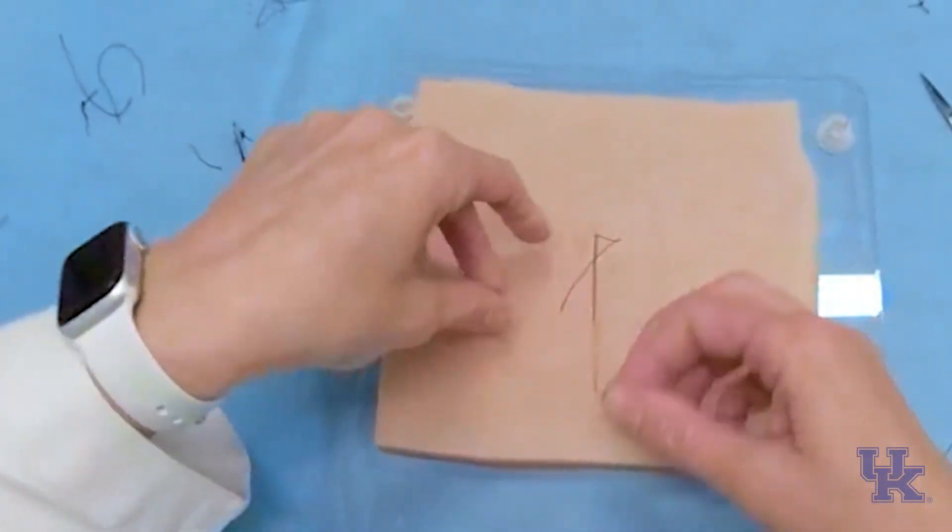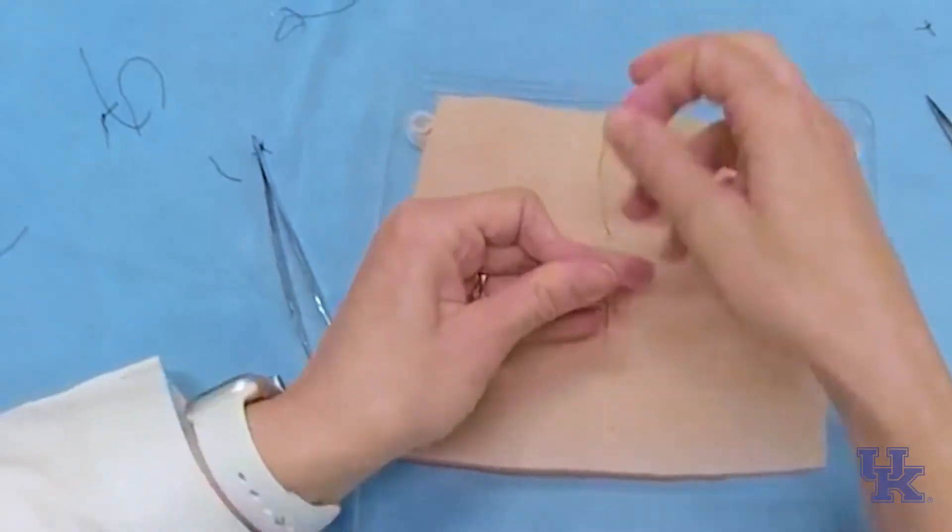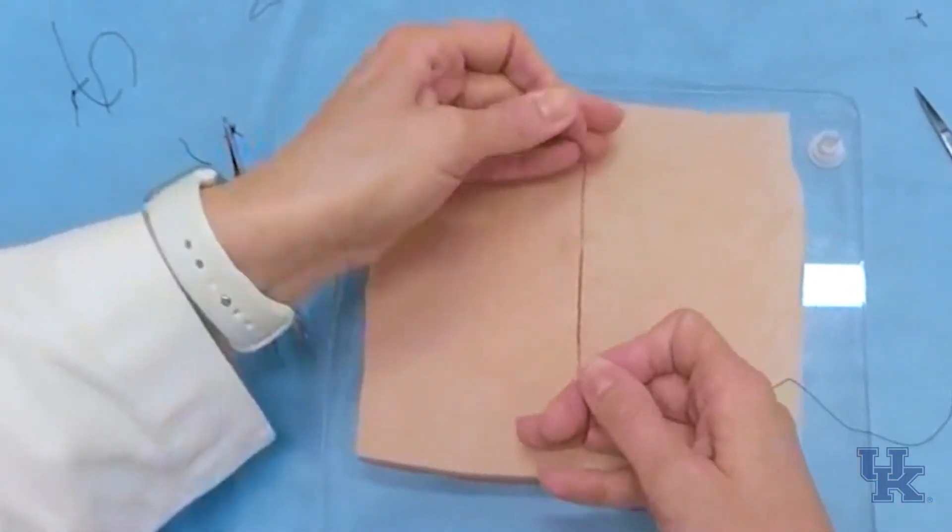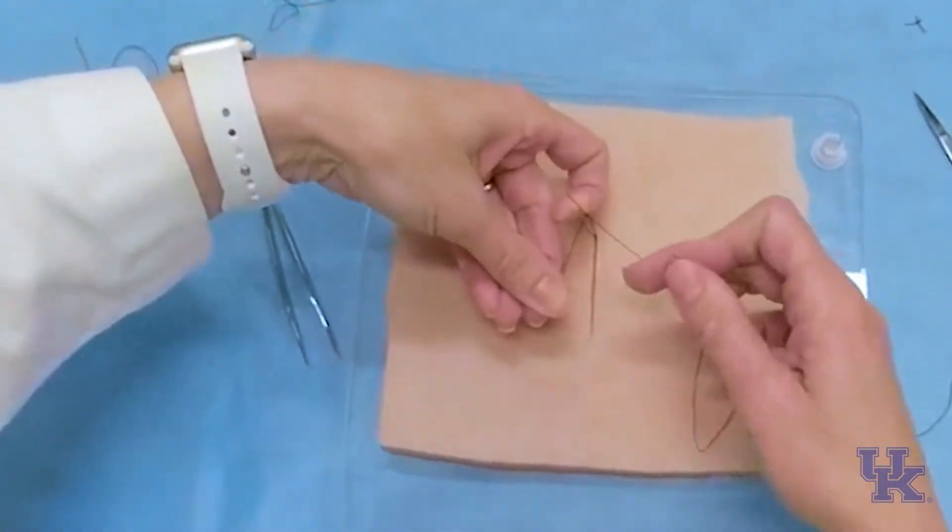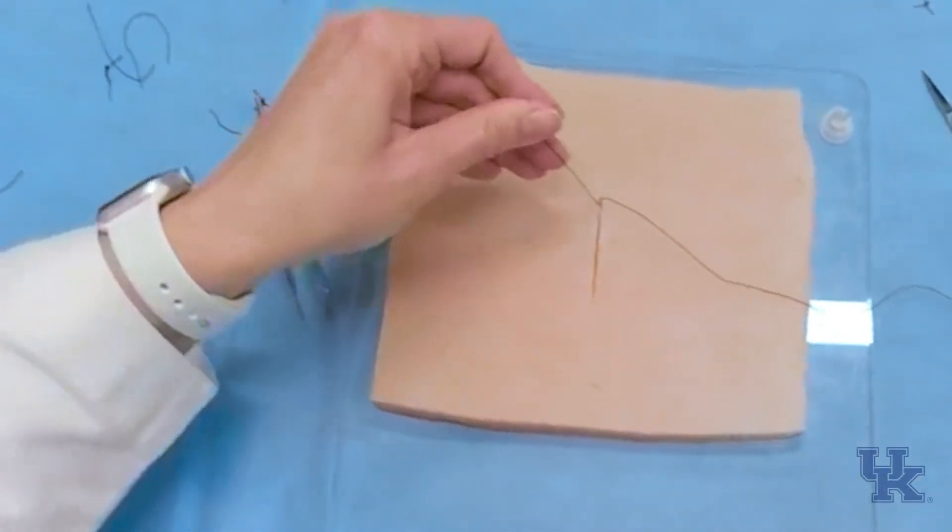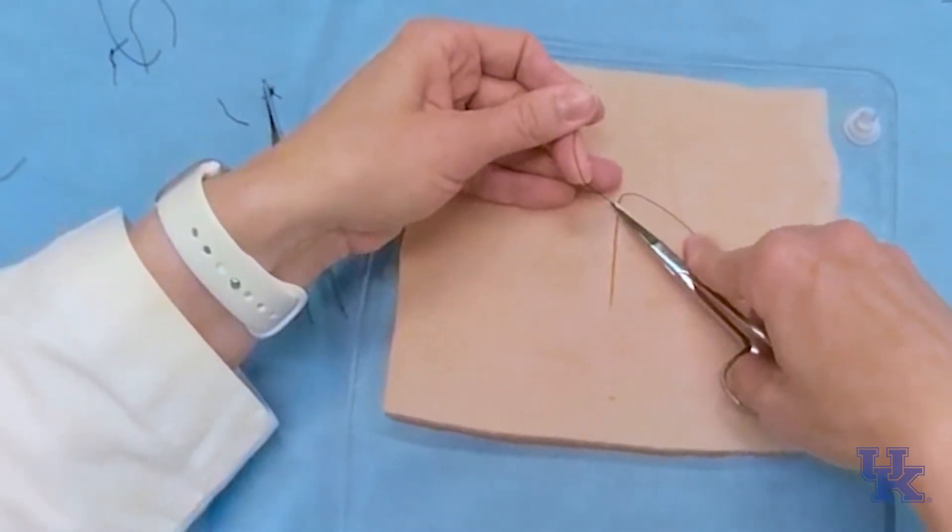Now if you were doing an interrupted, you would cut both of these sutures off, but since we're not doing an interrupted, we want to leave the needle end intact. So we're just going to cut the end without the needle.